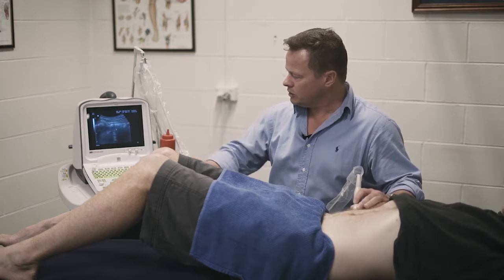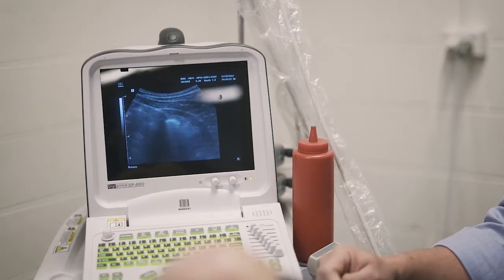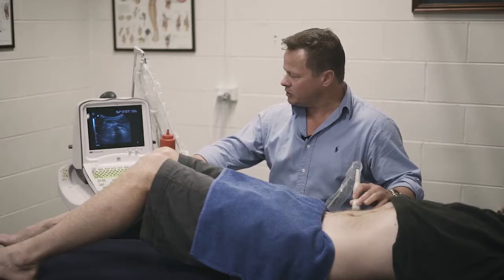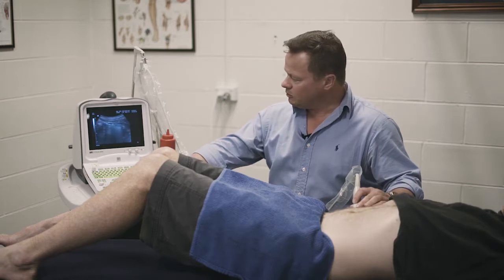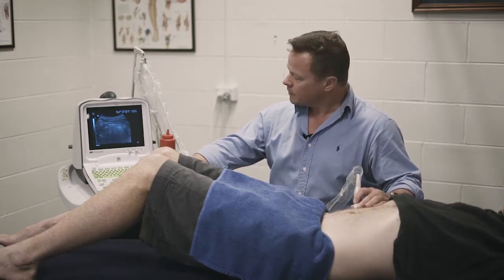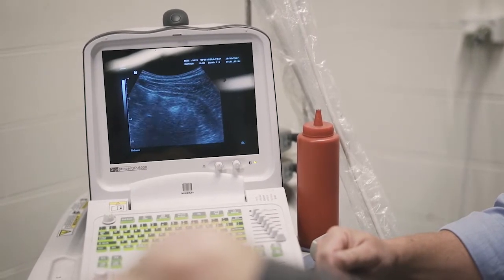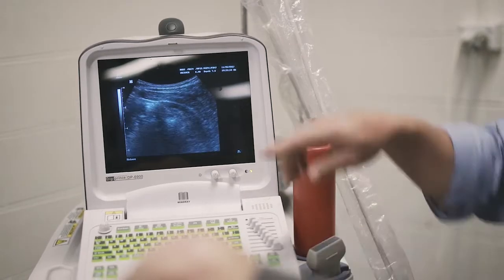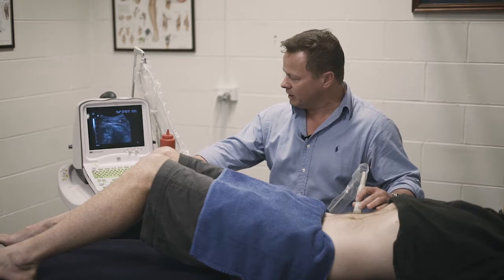I'll get you to turn on your core muscle as you perceive you should be doing. What we see straight away is a big gap between that internal oblique and the fascia — there's only a bit of movement in the transverse abdominus. Ideally, I want you to turn it on a little slower — let's get more thickness and movement through the transverse abdominus versus the internal oblique. As you can see now, the transverse abdominus works quite well; it's coming on before the internal oblique. If you squeeze a little harder, the internal oblique comes on afterwards — that's a really good sequence of activation.